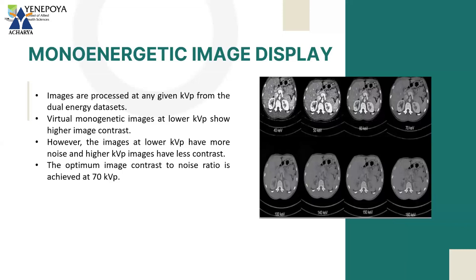Then you have to find out what kind of tumor it is. It may be a cyst as well. A cyst will have a specific Hounsfield unit, so it will be easy to understand if it is a cyst or a tumor. If it is a tumor, it will also have a specific Hounsfield unit. Then you undergo a biopsy and find out what kind of tumor it is. So everything is based on the Hounsfield unit, which is measured while the radiologist is diagnosing or doing the reporting.